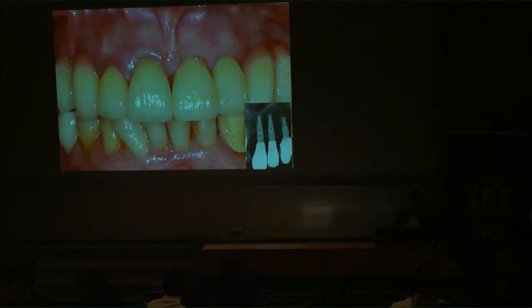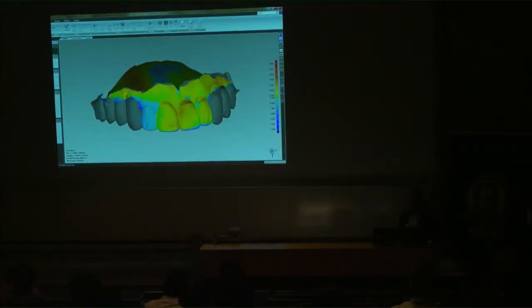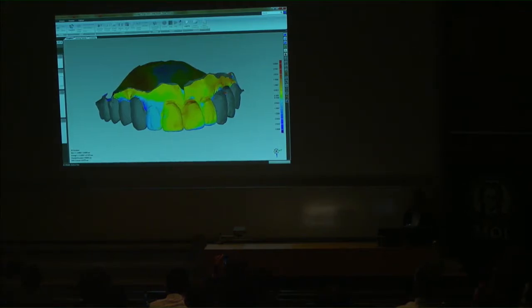Photo of 5 years post-op. The gingival tissue appears to be in perfect condition, with little dimensional change. This is confirmed by the GeoMagic engineering software superimposing her scans of the pre-op and 5 years post-op. The color mapping showed less than 0.3 millimeter discrepancy at the soft tissue region.